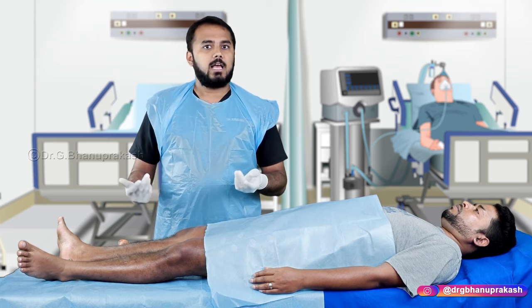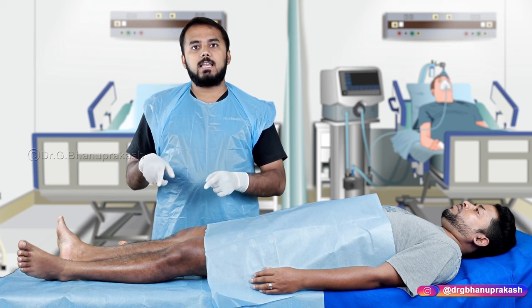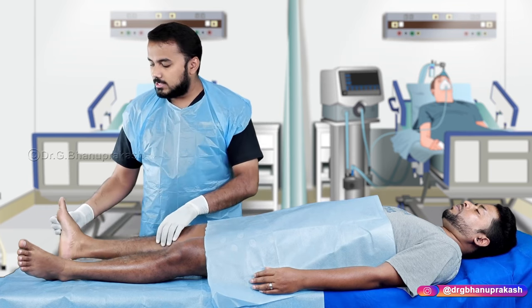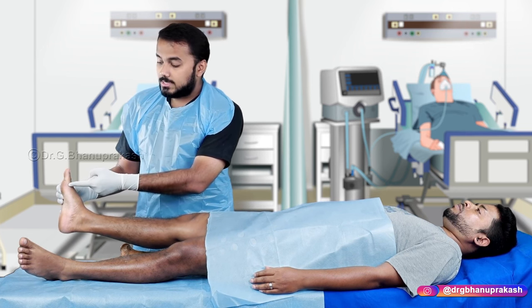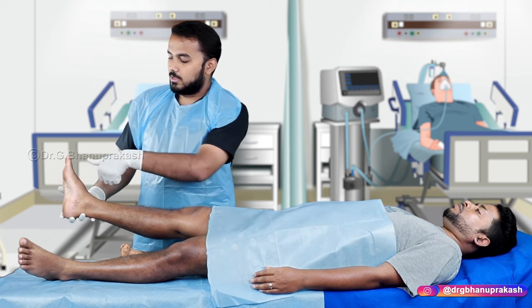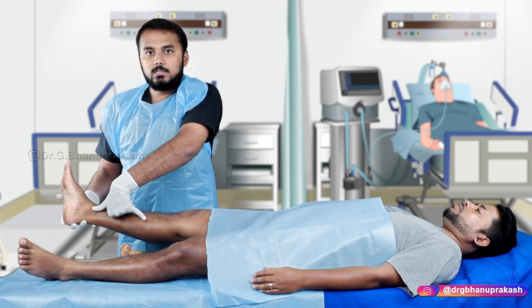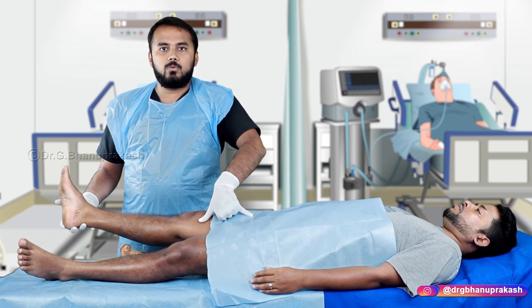For a slab, you must take measurements before applying POP — unlike a cast where you can just tie it directly. The slab is measured from distal to proximal. Starting from the base of the metatarsals, measure to the medial malleolus — that is one; from medial malleolus up — two, three, four. So for this patient we take a count of approximately three and a half to four digits.